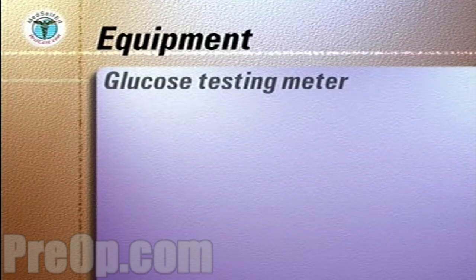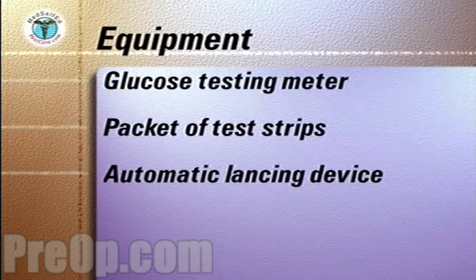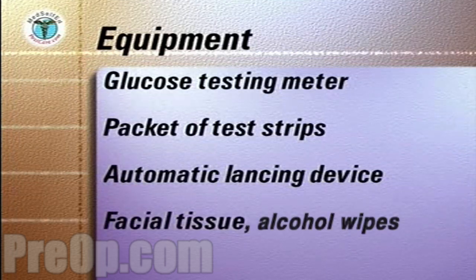The equipment you will need to assemble includes the glucose testing meter, a packet of test strips, an automatic lancing device, and facial tissue.